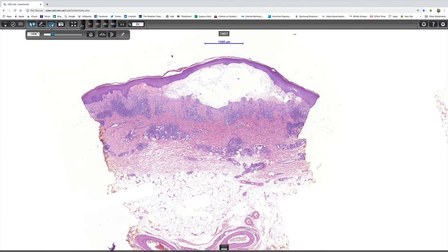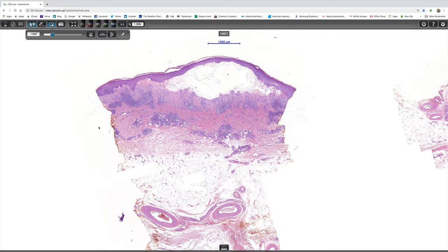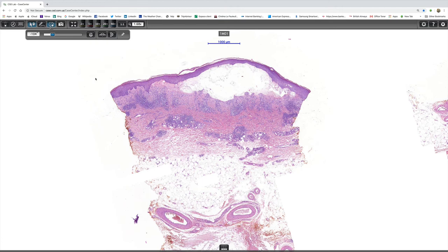I have made a separate video talking about these lesions in a more general sense but I want to focus on this one specifically. We can see a little bit of hyperkeratosis and then there's a blister cavity which looks sub-epidermal. The dermal papillae are sticking up into the blister cavity, and as I've mentioned before, this is sometimes called festooning.